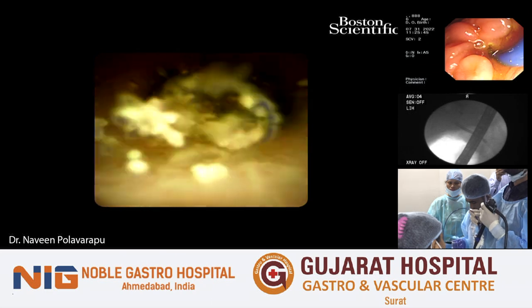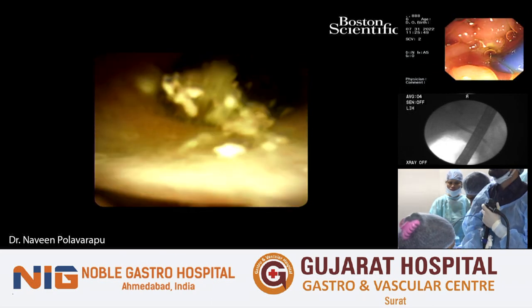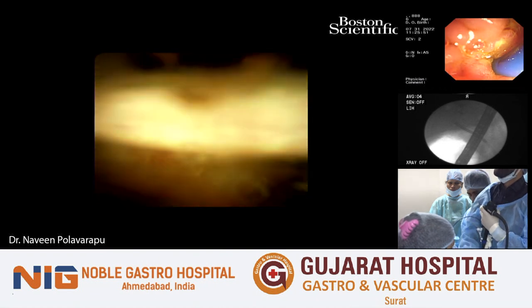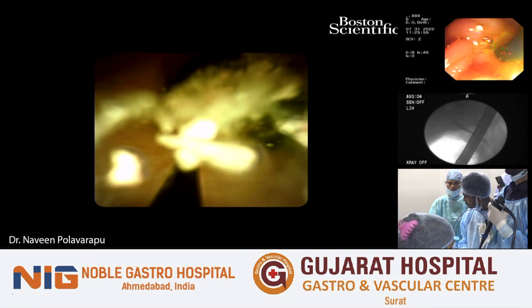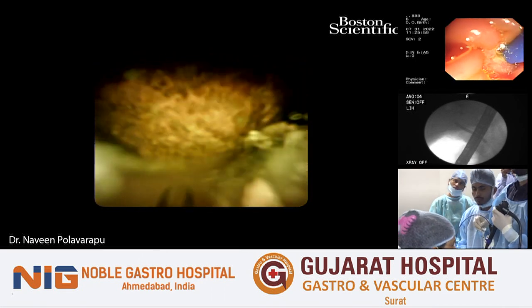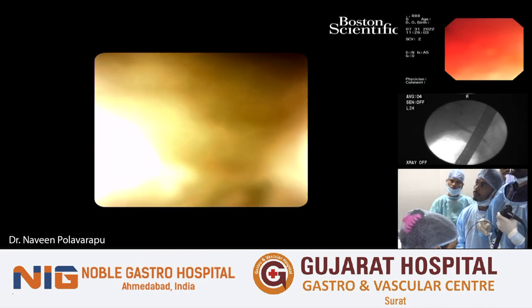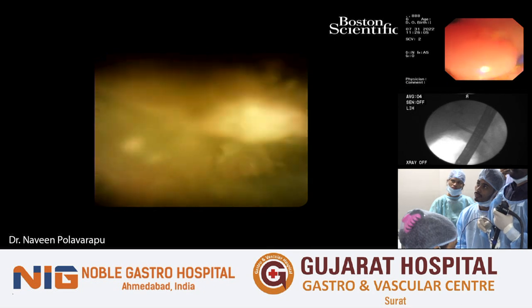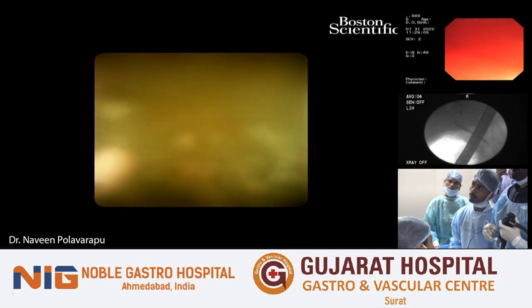See, the difficulty I think is because the stone is small. Yes, and it has already been in the intrahepatic duct. So I think that's the problem over here. Yeah. If it is a large impacted stone, we don't have this kind of movements. Yeah, absolutely. I think we already broke the stone. I think so. It's done.